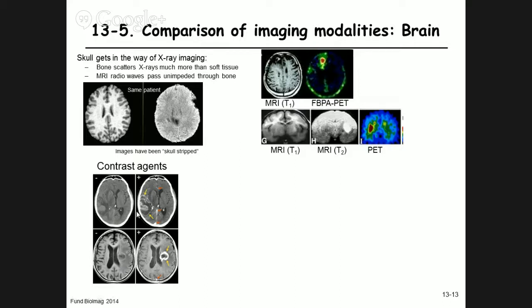And now on the right-hand side is the application after the contrast agent. So same image, before and after contrast agent. And here where you see the arrows, these are the ring-enhancing lesions. So these are ring-enhancing lesions in these patients. And that's the hallmark of cancer. At the edge of the cancer, the blood-brain barrier is being destroyed. That's where the cancer is aggressively destroying healthy tissue. So here's CT, MRI, pre and post contrast. Completely different contrast mechanisms, but in a way able to depict the same thing.